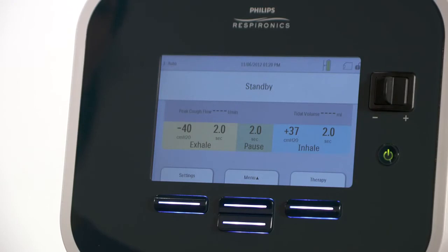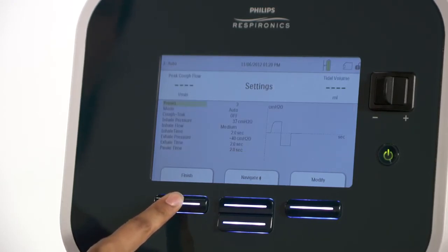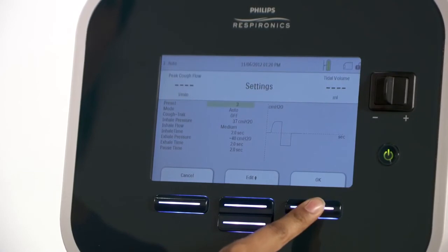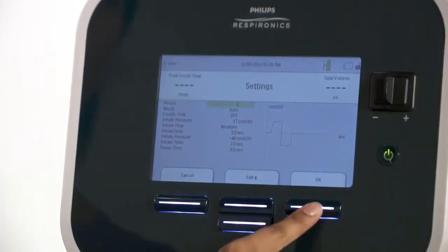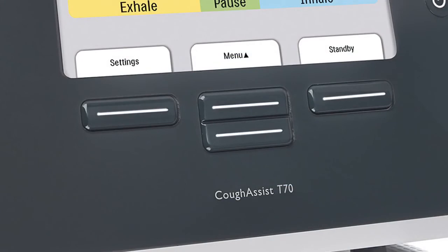A specific prescription can be entered during standby, but titrating is easier to accomplish during therapy. To enter prescribed settings, press the left button under Settings. A setting menu will appear. The first item on the list will be highlighted, in this case, Preset. Press the Modify button. You can select which one of the 3 presets you wish to modify. Press the OK button to confirm the preset. You can select other settings by using the center Navigate buttons.